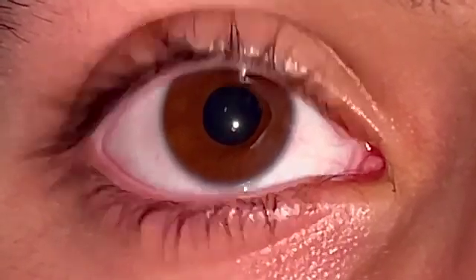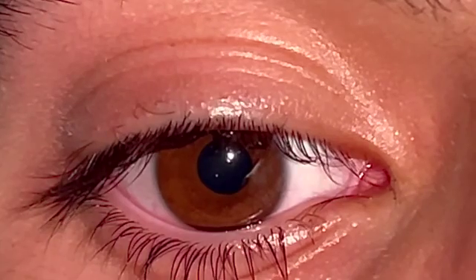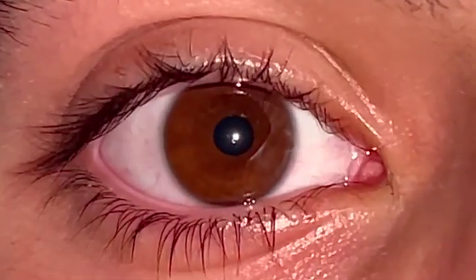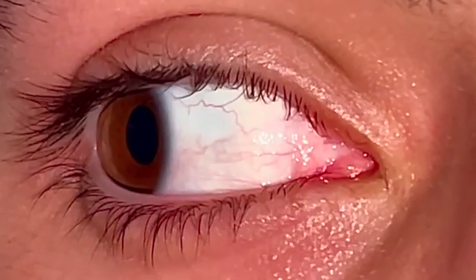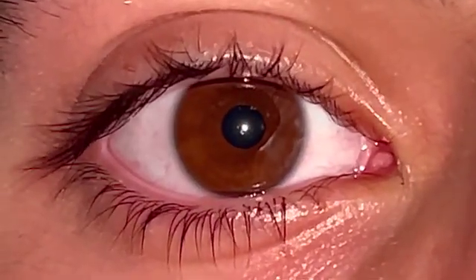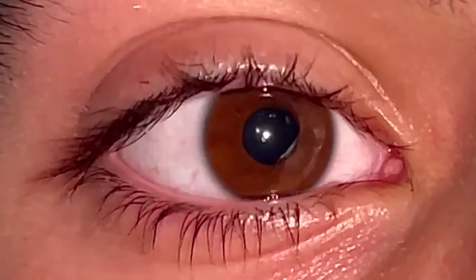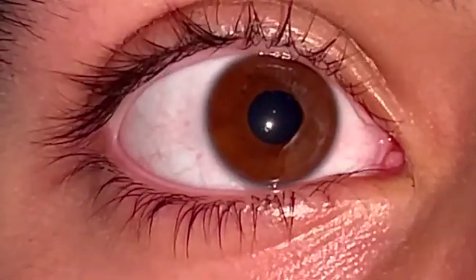This comes in two types. The permanent punctal plug can last several years, and the collagen punctal plug can last around a couple of weeks to a few months max. The collagen punctal plug is more like a tiny thread device made from collagen to offer temporary relief depending on the severity of your situation. This is the one used to demonstrate the procedure.